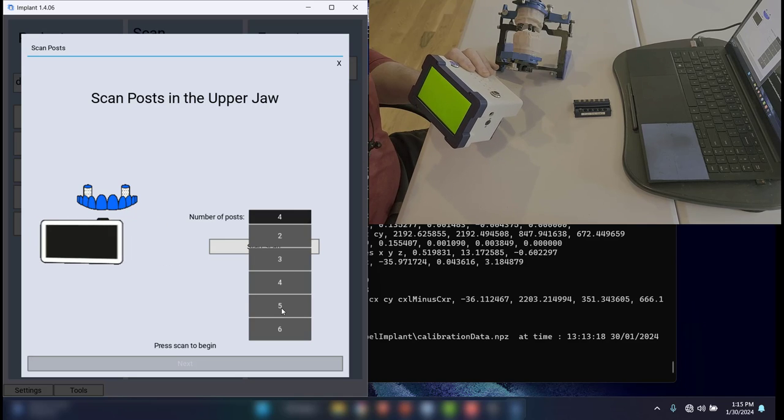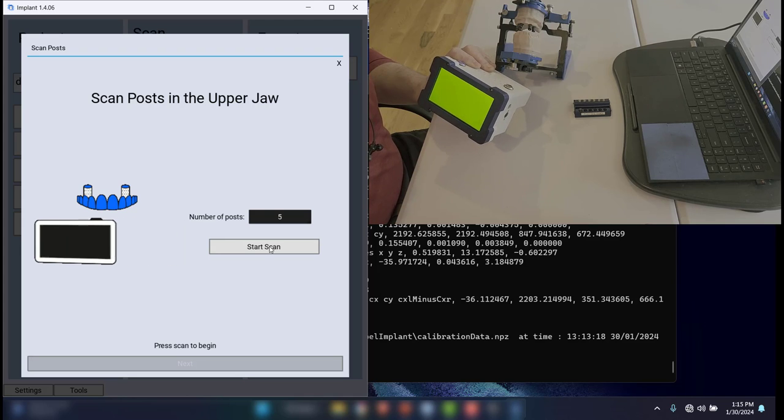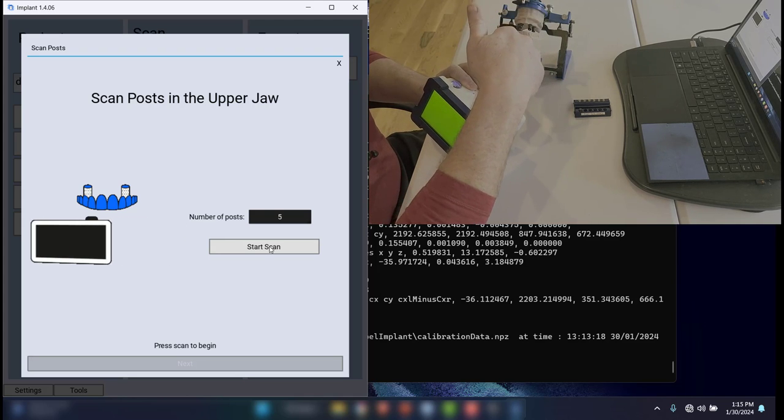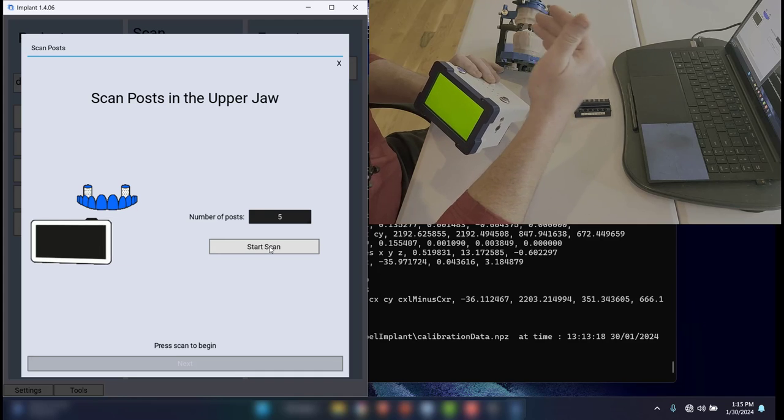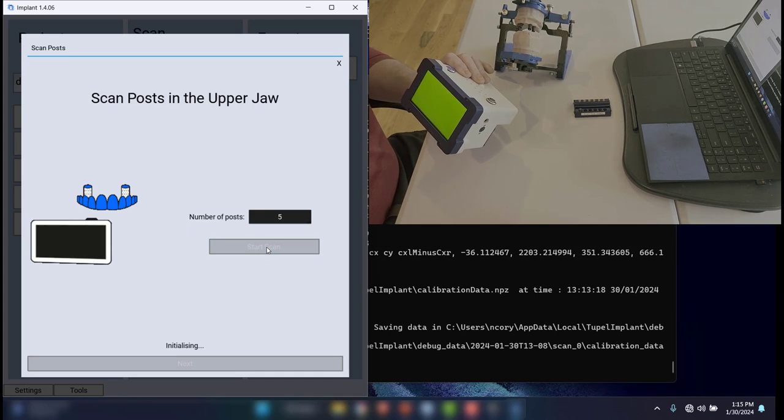So just be aware. Tell it how many posts you're scanning. I'm going to do 5 posts. And I've moved the incisal pin just because it was going to be in my way. Obviously, you're not going to have an incisal pin in a patient's mouth. So now I'm going to hit start scan.